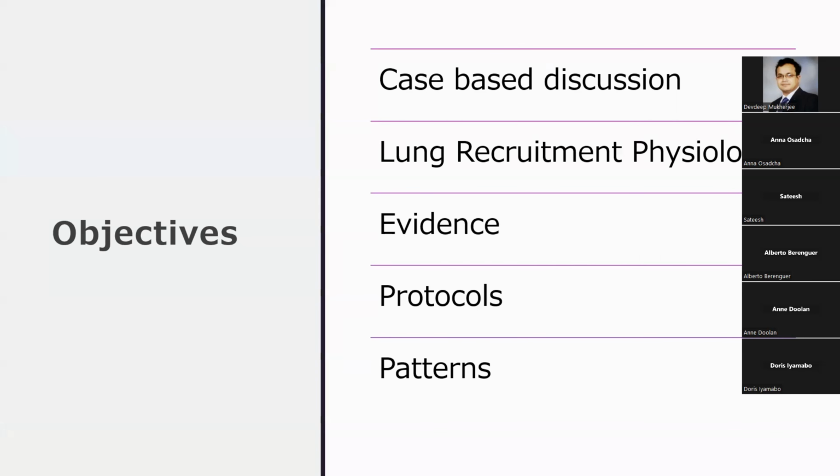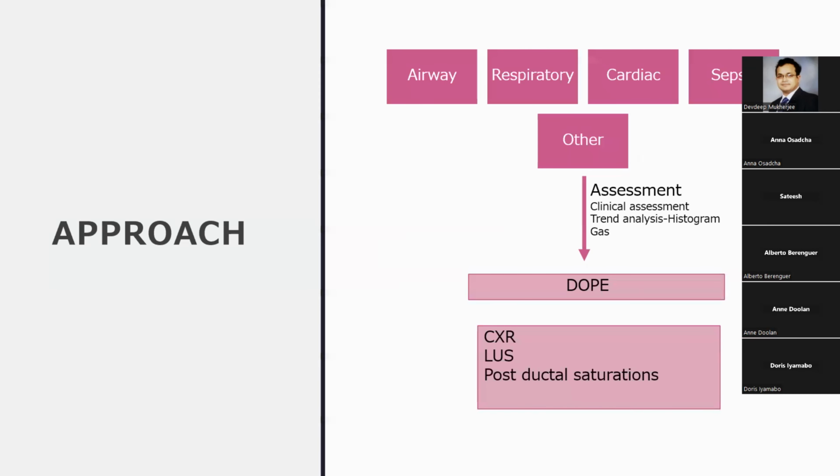Now, today's session will be a little bit interactive. We're going to have a workshop. We're going to have a case-based discussion first, and we're going to nominate a few of you to talk through a case that I'm going to show you. We're then going to focus on lung recruitment physiology and the importance of heart-lung interaction, followed by what evidence there is currently for the use of lung ultrasound in the process of lung recruitment, but then talk about the neonatal protocols and how we implement them, as well as patterns of lung ultrasound that correlate with recruitment.